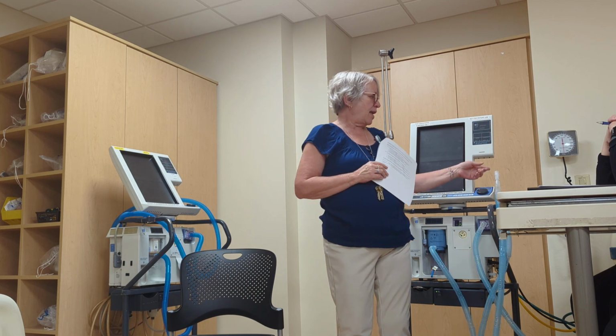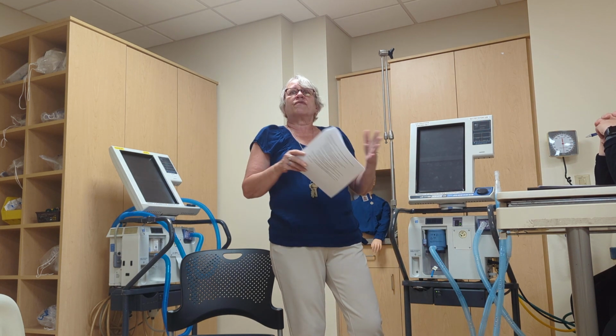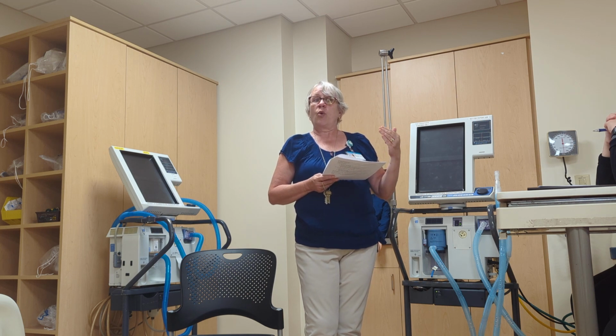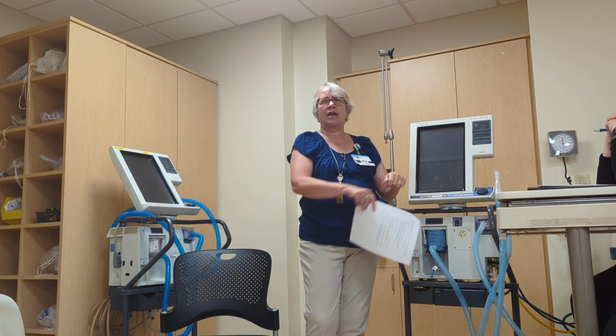When I switch between an HME, and I don't have my heater out here, it's probably on that one, or a dome heater, I lose volume in that dome heater. I do that SST and my ventilator will calibrate for that. Does that make sense? Okay. So if they don't, what they're gonna do is they're gonna say, oh my gosh, I changed my circuit, and look, why am I losing 100 milliliters? I gotta find my leak. No leak. Why am I losing all this volume? Because you didn't recalibrate.